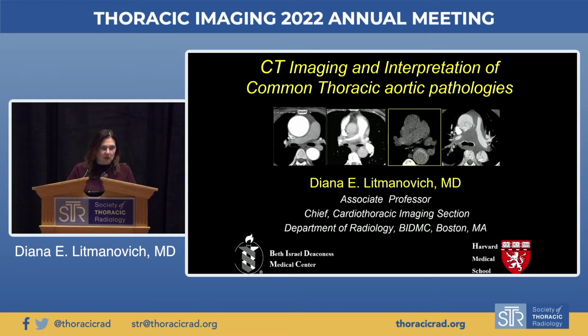thoracic aortic pathology. Now, it's a huge topic, and there are meetings of several days which are just devoted to that one topic. So I'm not going to try to cover everything. I'm going to talk about potential tips that you as the newcomers to the world of radiology might find beneficial.